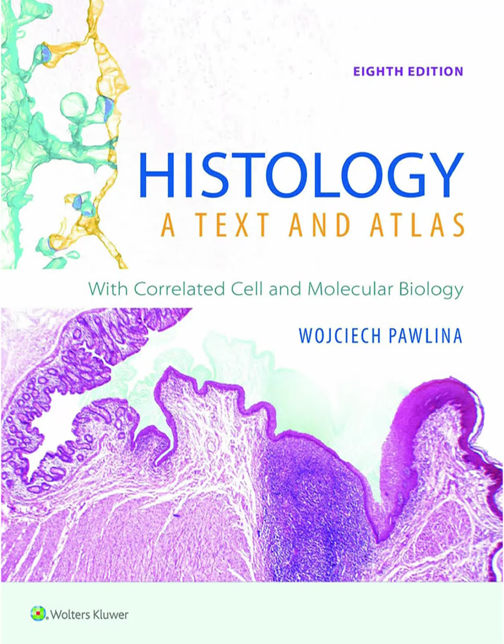So the antibody finds its target, and the tag lights it up. Precisely. We have two main types of antibodies used. Polyclonal, which are a mixture recognizing different parts of the target molecule, and monoclonal antibodies. These are amazing. They come from a single, identical cell clone, so every antibody molecule is exactly the same, targeting one very specific site or epitope on the antigen. Monoclonals sound very precise. They are. And they have absolutely transformed medicine. They're used routinely for pinpoint tumor diagnosis and typing. They can distinguish different types of lymphocytes, for instance, and they're even used therapeutically for targeted drug delivery, guiding drugs directly to cancer cells. That's huge.